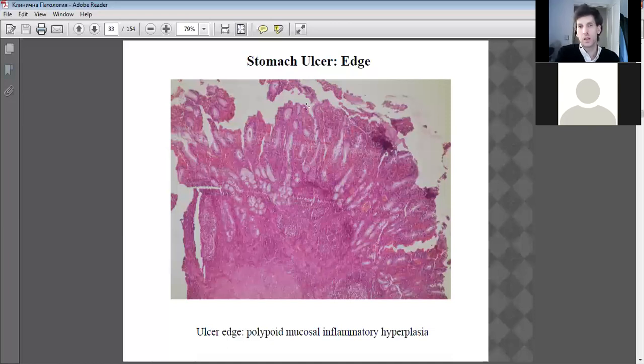And the whole lining of the stomach is deteriorating rapidly. There's some bleeding as well. Some examples here of blood vessels. Eventually these will rupture and cause bleeding. Yeah, and some of the fibrous tissue is beginning to appear at the bottom here, and over there as well, as it moves towards the rough edge of the ulcer. Now these straight lines are, of course, the sectioning artifacts, and they cut the tissue on the slide.